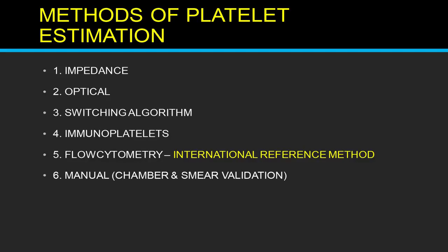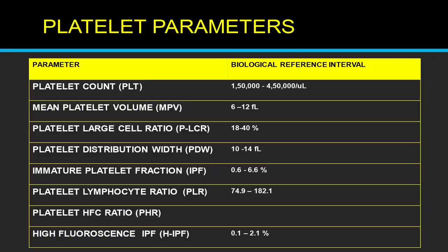Last but not the least, we have the manual platelet estimation using chamber or smear validation. And this has stood us in good stead for all these years where we were purely relying on impedance based technology. A lot of us used to do our smear reviews to estimate all those giant platelets and arrive at the manual corrected platelet count, and it still holds good because the vast majority of India is still on impedance based methodology.